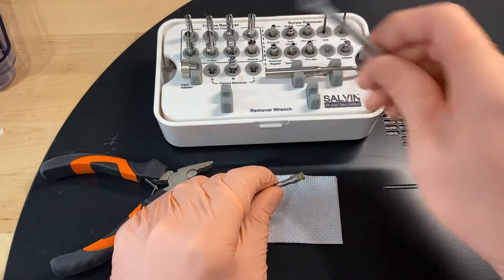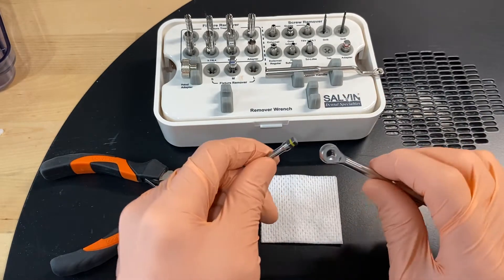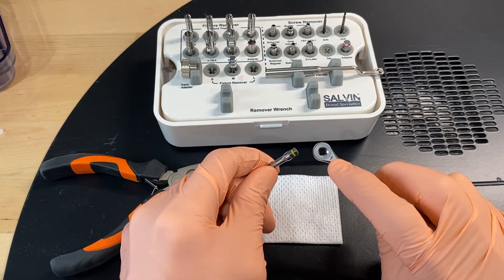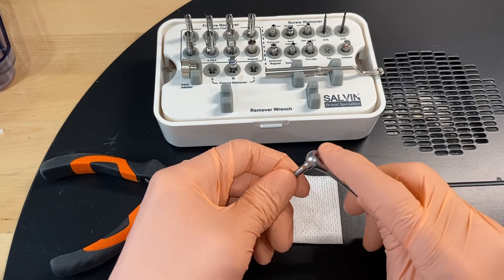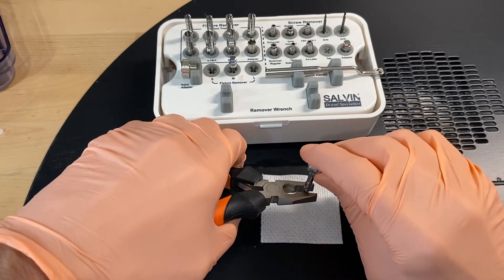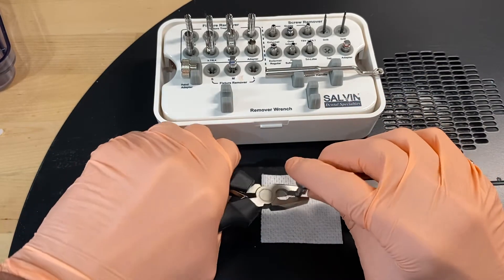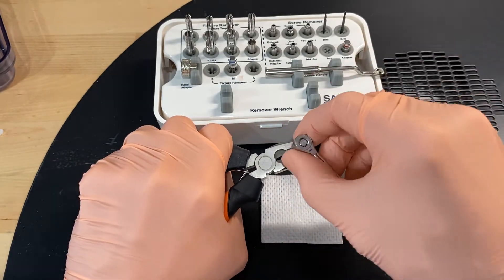So you grab your wrench — this is our Salvin implant removal kit — and then you're gonna look at the arrow here and take it clockwise. Then you'll grab the removed implant with the pliers and just turn it clockwise.